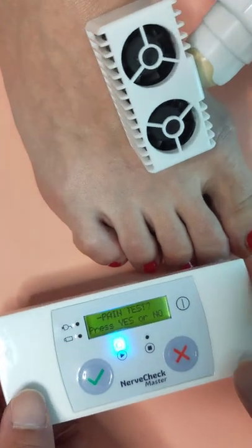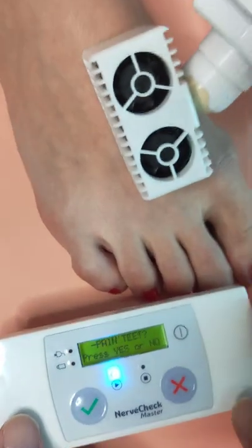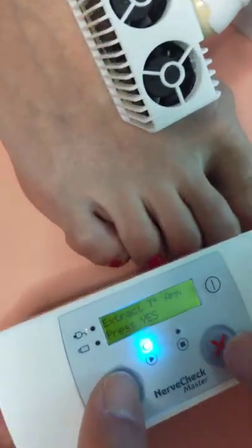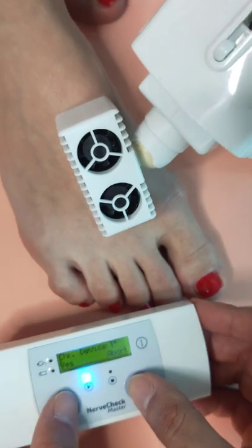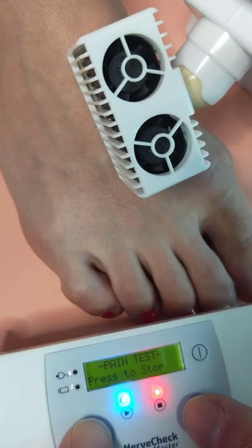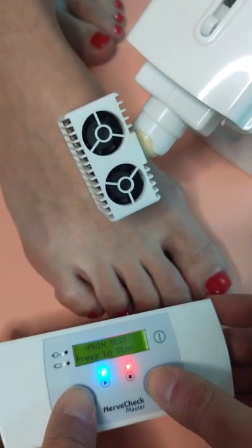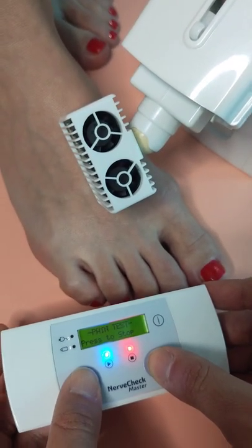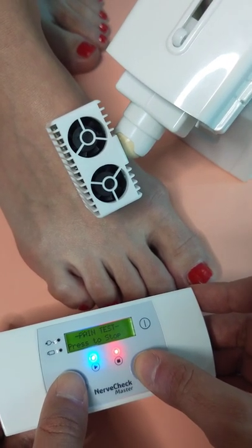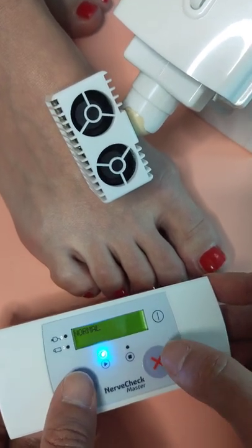I'm not going to do the warm test because it's similar to the cold test, so I'm moving on to the warm pain test. In this test you will click yes when you start feeling that it's uncomfortable rather than when you feel it's warm. Let me know when it's getting uncomfortable. It started — and it's normal.